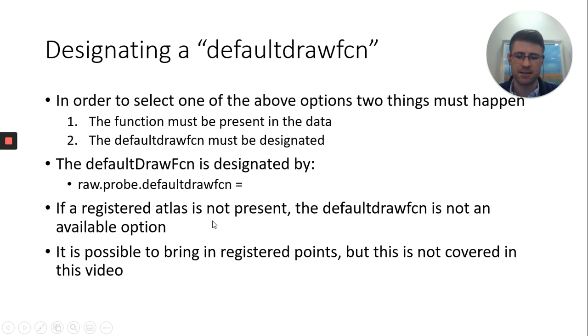And then start typing D, E, and hit tab and see if anything comes up. If it doesn't come up, it's likely that you actually don't have an atlas there. So it is possible to fix this. If you don't have it, you can actually load in registered points into the probe, but I'm not going to cover that here. I'll hopefully have another video on that in the near future.